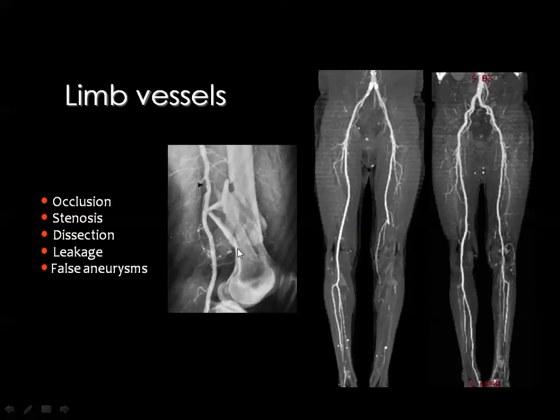And then instead of introducing needles in the femoral artery and giving the patient general anesthesia, you just introduce a cannula in the antecubital vein, injecting contrast material, then say to the machine, I would like to see the femoral circulation. Then the machine is programmed at the time where the contrast material will reach the site of the femoral arteries, then start the scanning.